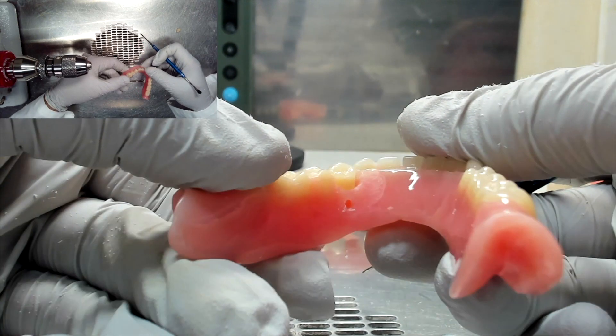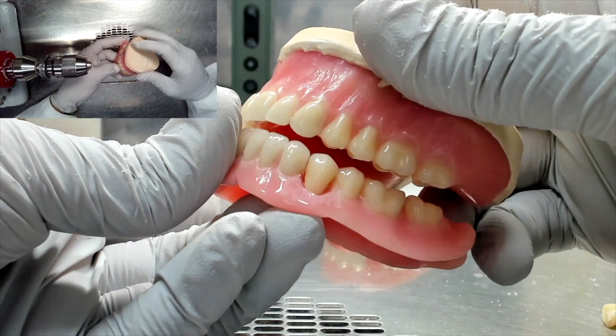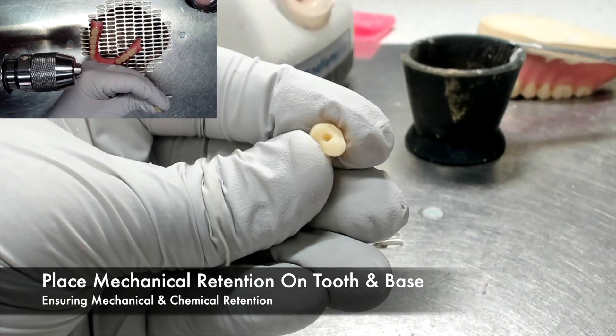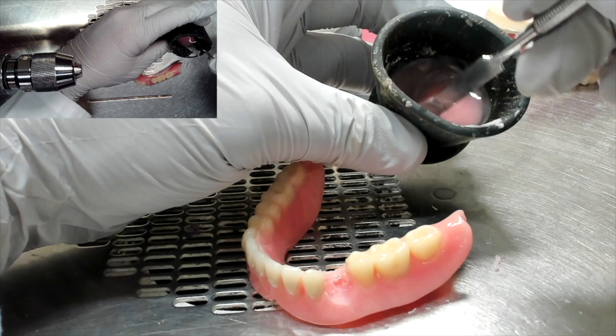When repairing a posterior tooth fracture, it's important to use the opposing denture to make sure that the tooth is in proper occlusion. Once the tooth is fitted into the space, you can place mechanical retention on the tooth and the denture base. This makes sure that not only do you have chemical retention, but that you also have mechanical retention.